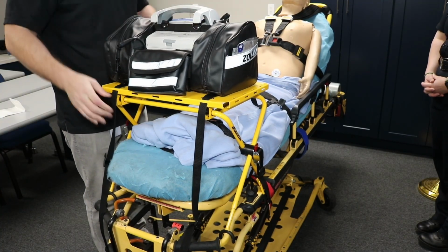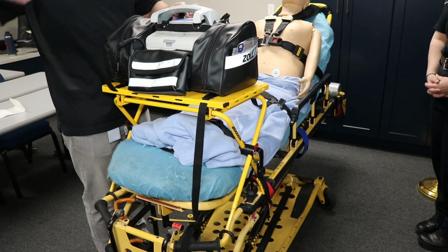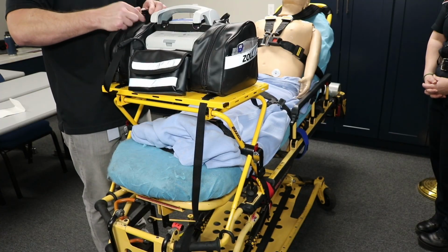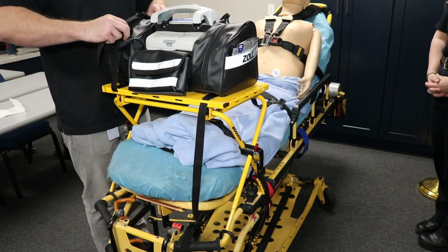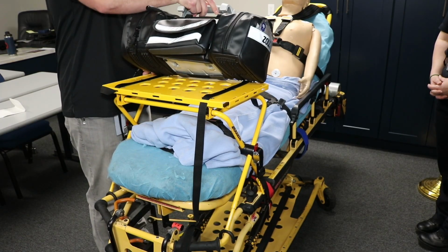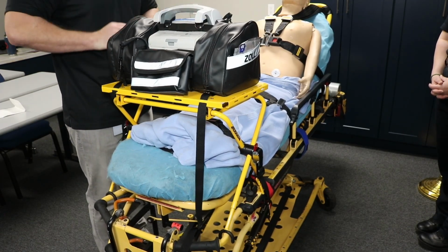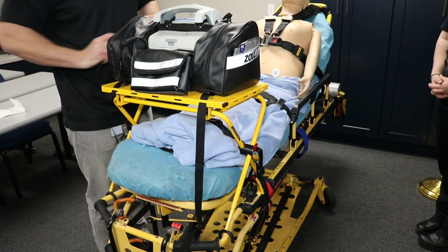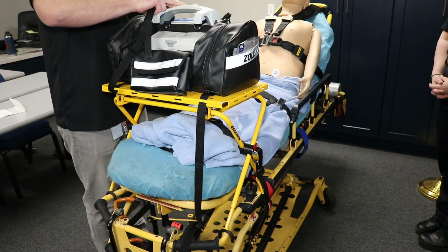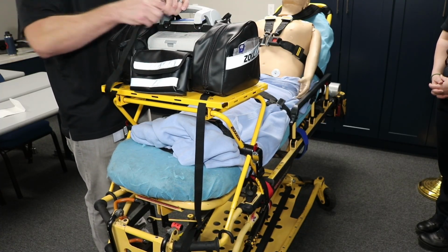I'm going to come in with the monitor here, and make sure that the monitor is facing the patient. With our hard points of contact, I just want to make sure that we go through the handle here, not over the saddlebags here. Sometimes these saddlebags can fall off, and on a hard stop, the monitor can land on the patient. So I always say make sure we have hard points of contact going through the handle here or some other point of contact.